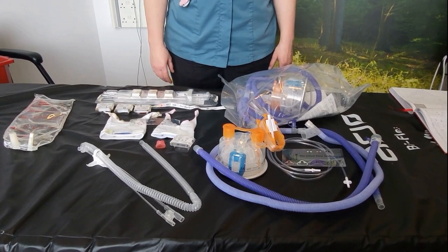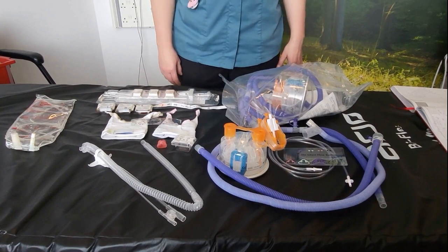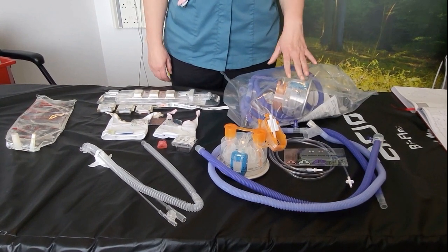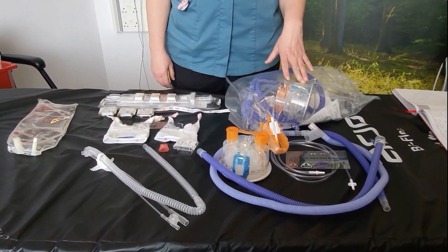Before you start using your SIPAP machine, you need to gather your equipment. The equipment required is a circuit, so for the SIPAP you'll need the Airlife Single Limb Heated Wire Circuit Kit.